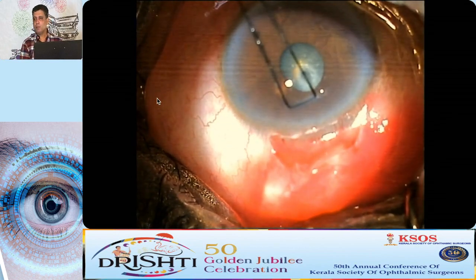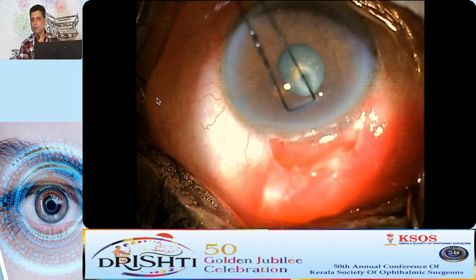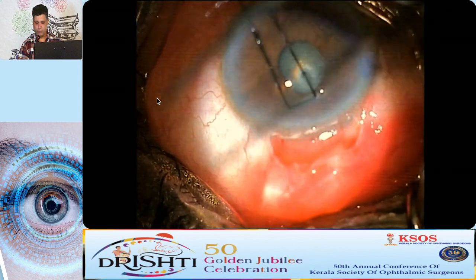And with small sponges, sometimes you end up in a little difficulty when you try to remove the sponges. You can have these multiple small sponges getting trapped there and end up fishing for them.